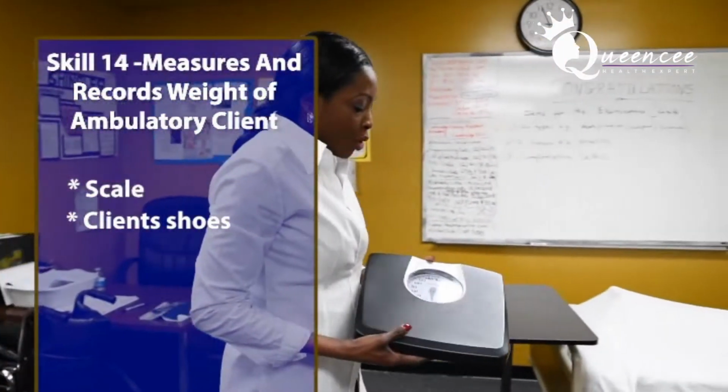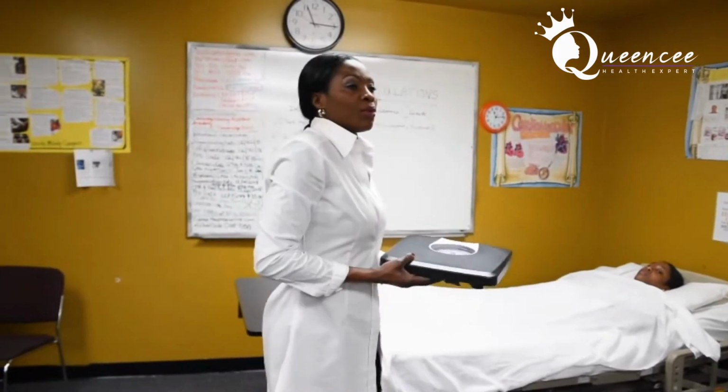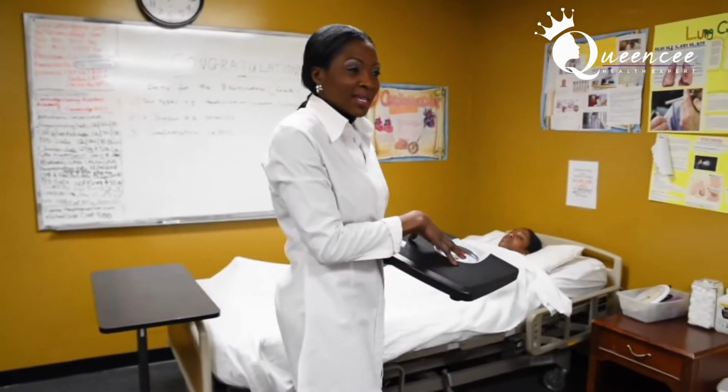Okay. When you get the scale, whether you are using a standing scale or this particular bathroom scale, you are responsible for moving it from wherever the examiner has set the scale to 0. Meaning you are responsible for balancing the scale.